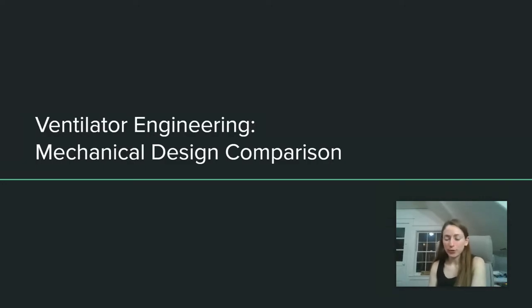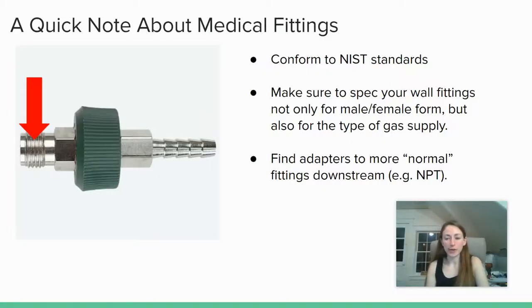So before we do that, I just wanted to make a quick note about medical fittings. I don't think it's worth dedicating an entire video to tech speccing for some of these smaller components like fittings, but I have noticed that people are asking about how they can figure out exactly which medical fittings they need to connect their device to the gas supply at the wall of the hospital. So I think it's worth noting that medical fittings conform to NIST standards.